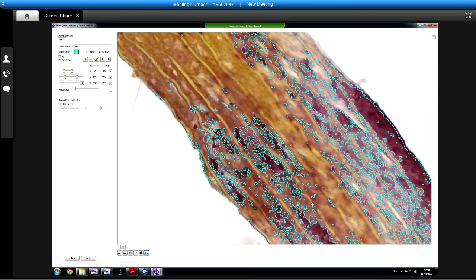Tell you what, as we're doing quite a strong colour here, let's just try it in RGB. So it just warns you that if you change it, it will just start from scratch again. So let's do it like this.